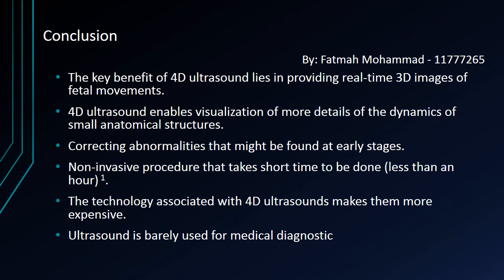On the other hand, the technology associated with 4D ultrasounds makes them more expensive, and they are not generally offered as part of a routine obstetric service. If parents choose to have a 4D ultrasound done, they will need to pay for this procedure themselves. And finally, 4D ultrasound is barely used for medical diagnosis.